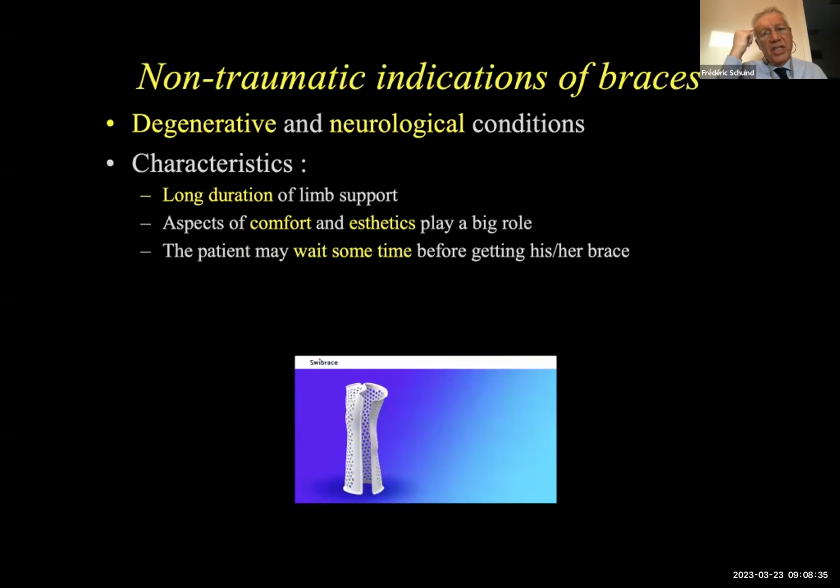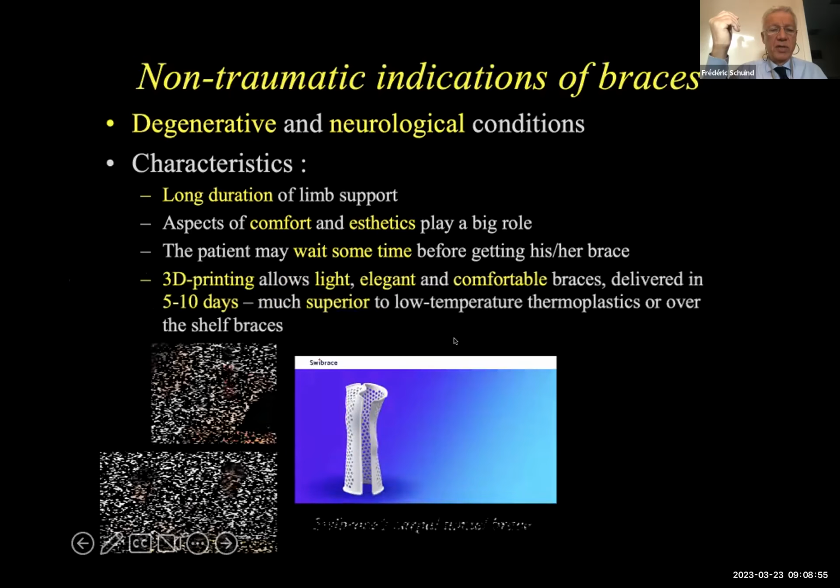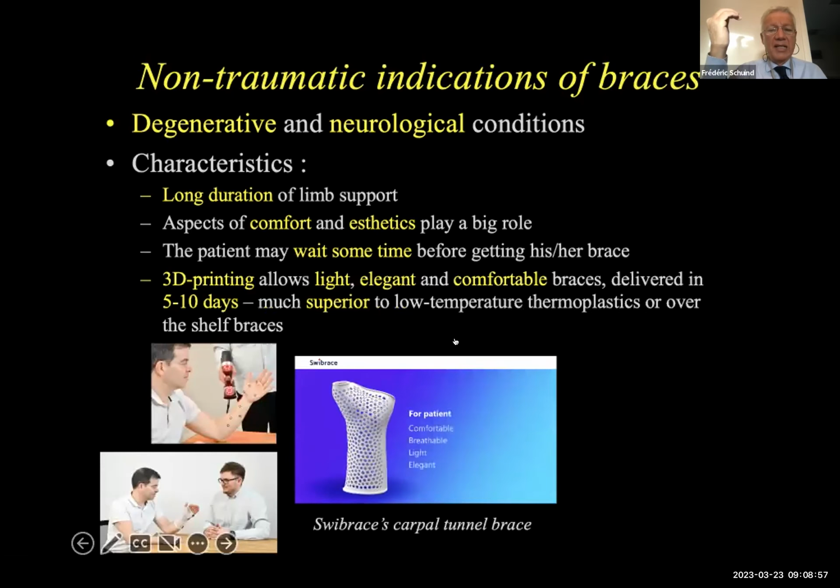These non-traumatic indications are degenerative and neurological conditions. What are the current characteristics? There is a long duration of limb support, so during months, sometimes years. So the aspects of comfort and aesthetics play a big role. But the patient may wait some time before getting his or her brace. Slide, please. Slide, Clemence. And 3D printing allows light, elegant, and comfortable braces which are delivered after a few days, which are much superior to low temperature thermoplastics or the over-the-shelf braces, like you can see on your right.